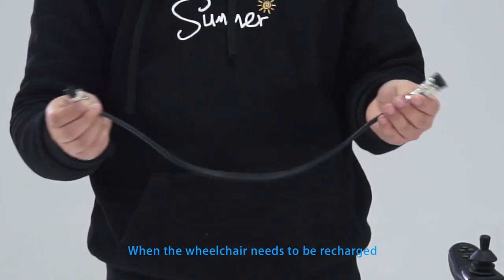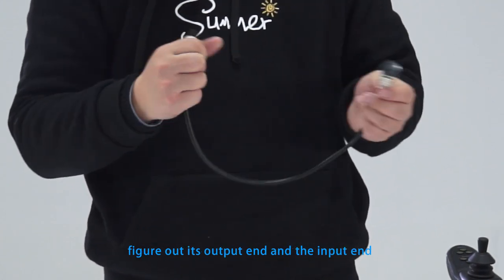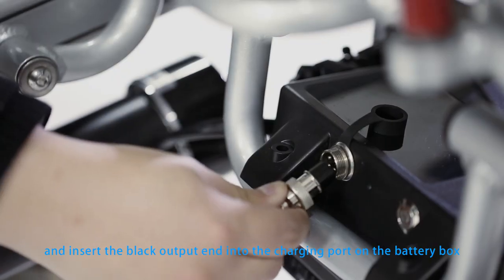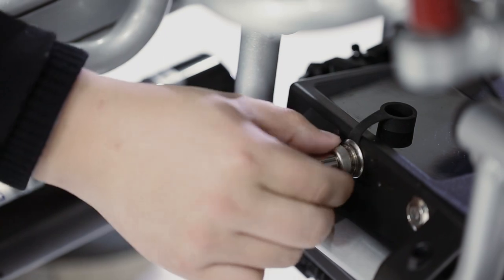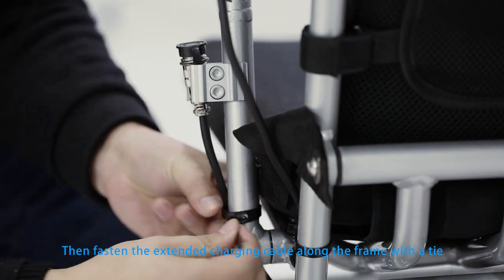When the wheelchair needs to be recharged, please take out the extended charging cable, figure out its output end and the input end, and insert the black output end into the charging port on the battery box and screw the metal ring to fix it. Then fasten the extended charging cable along the frame with the tie.